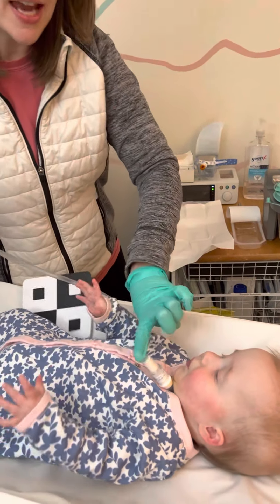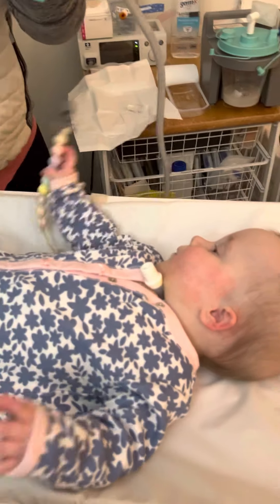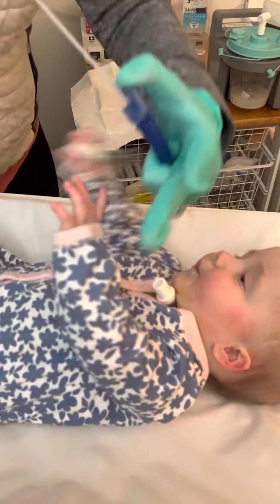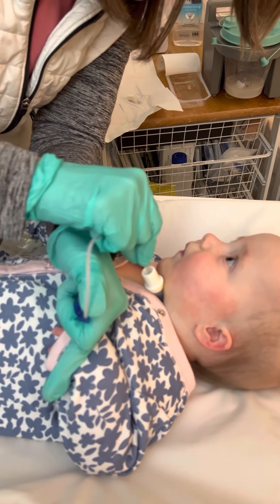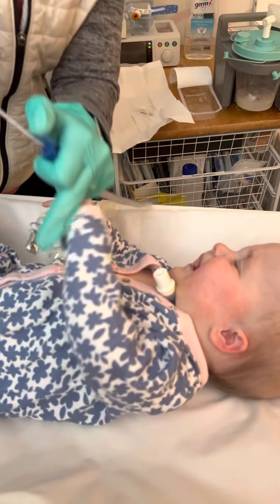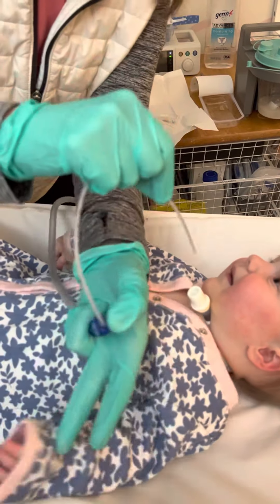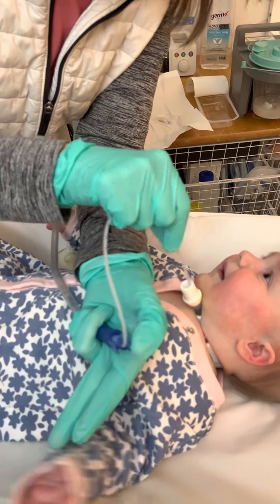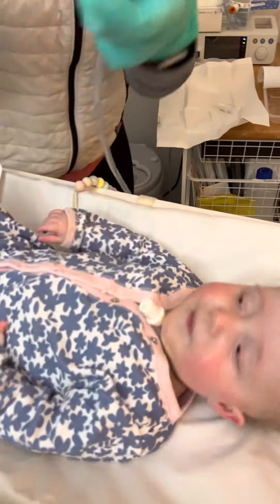I'm going to take her HME off, set that aside, and occlude my suction catheter. I'll put my hands there, go in to my fingers, twist, and come out. Then I listen and go in one more time, holding it the whole time. And then I go in one more time.